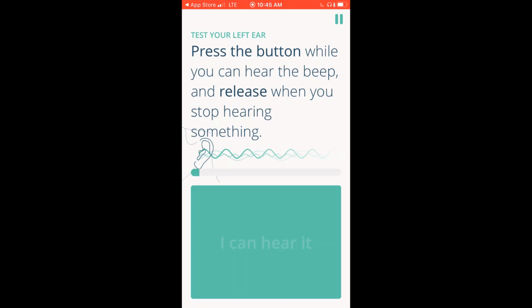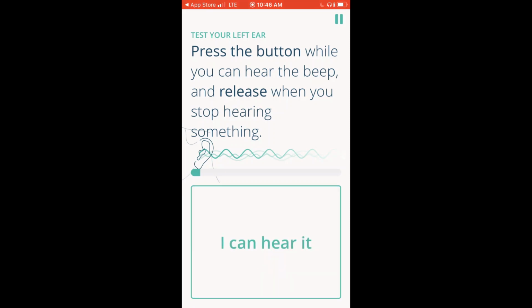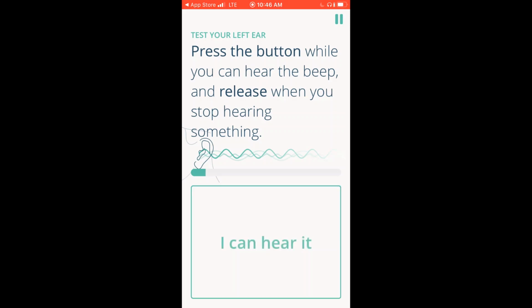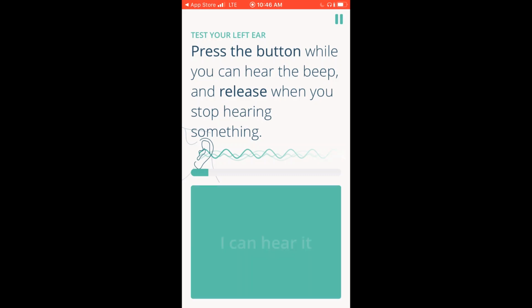Now you won't hear anything here in this recording because I have it in my headphones, but I'm pressing when I hear a sound, letting go when I no longer hear a sound. And this will happen for your left ear, and then it will switch to your right ear or vice versa. Sometimes it will start with the right ear as well. So you'll just go through this.